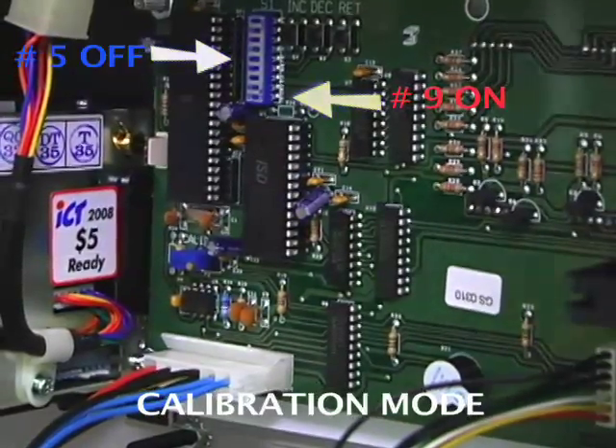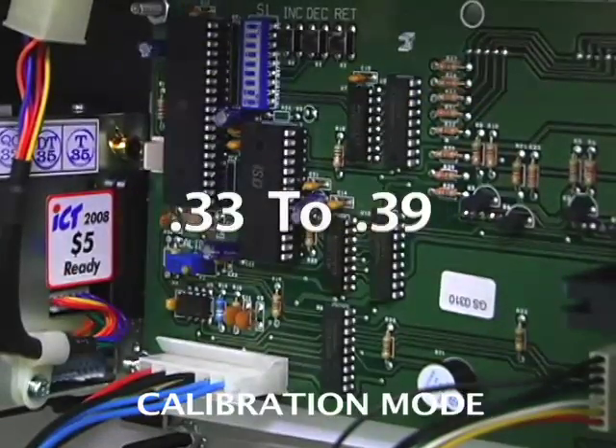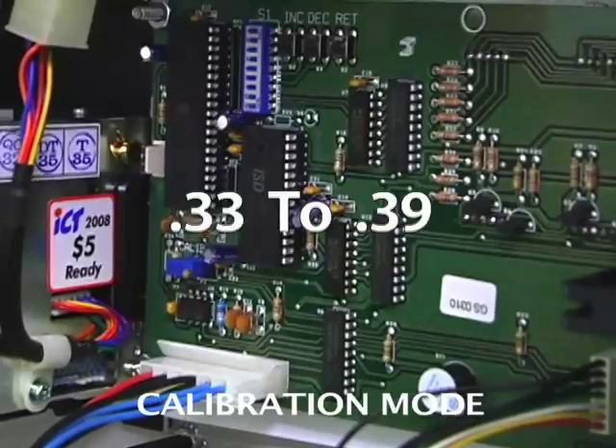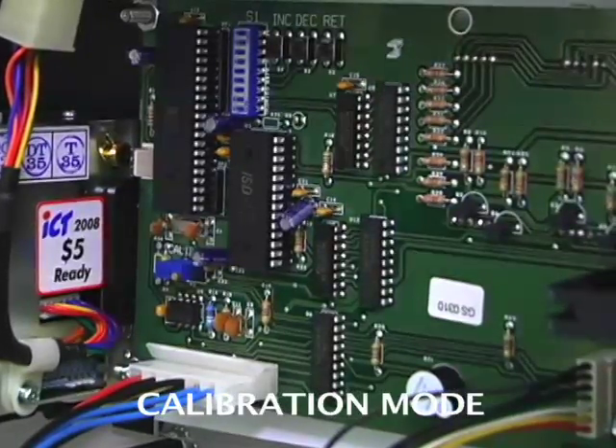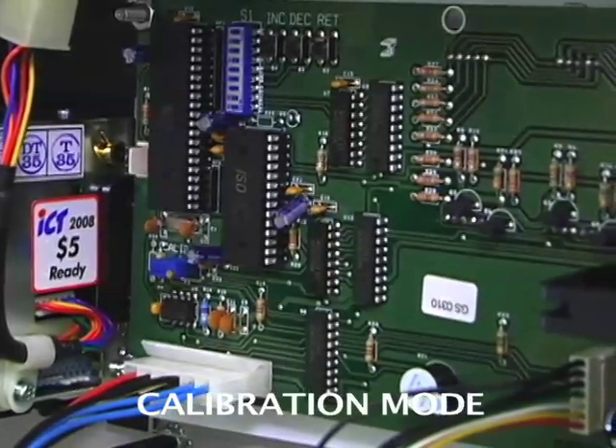The goal to calibrate the AlcoBuddy is to get the reading anywhere from 0.33 to 0.39. If we blow into the machine with the solution and it reads higher than 0.39 — for example, 0.51 — then we know the solution reading is too high.